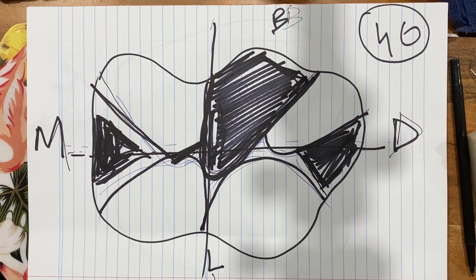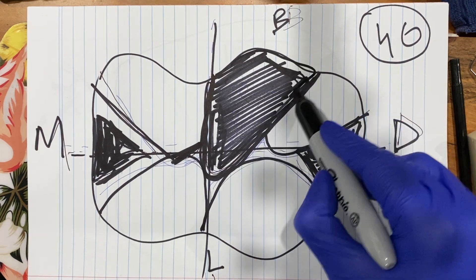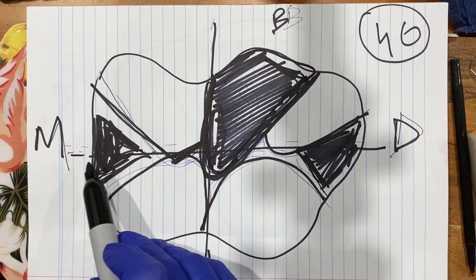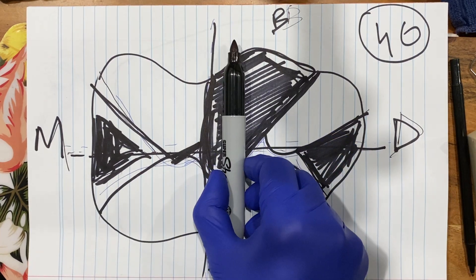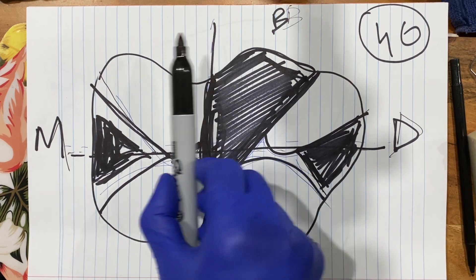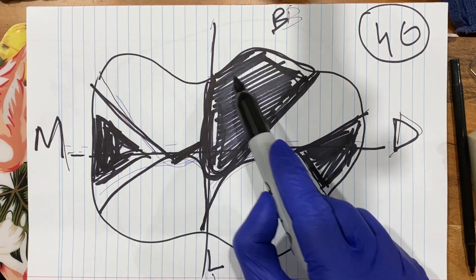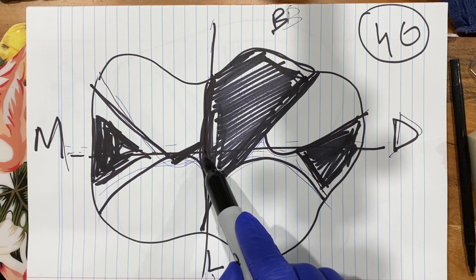So making sure whenever you do your molar amalgams, this is your demarcation A. If your A is good, imaginary line center, when it goes to the mesial side, when it crosses to the mesial, it only just touches, crosses.